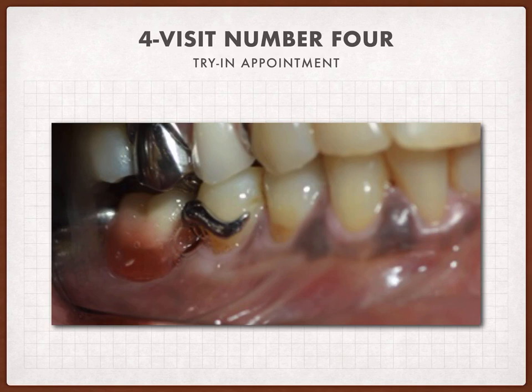And finally, we check the phonetics. If it is a class 4 removable partial denture, or the teeth that are replaced are anterior teeth, we ask the patient to say 15.